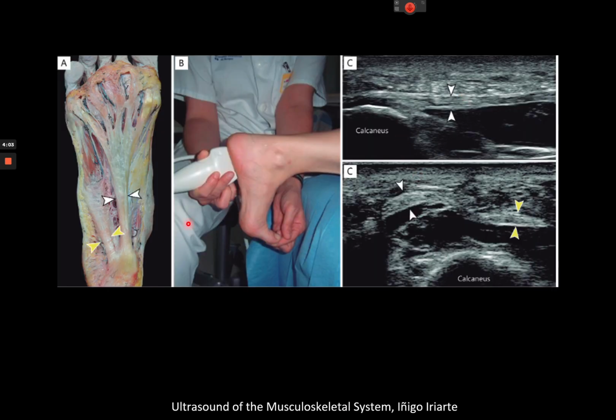This is our orientation. So this is our long axis view. Most commonly when we scan the plantar fascia, it's in long axis. Again, the sonographer is putting some tension on the plantar fascia, so we can see that nice taut band through there. There's the calcaneus. And just in terms of anatomy, we've got our medial tubercle where we've got this central band here, and this is our lateral band. And this lateral slip of the plantar fascia inserts into the base of your styloid process. This is actually what causes a styloid avulsion fracture.